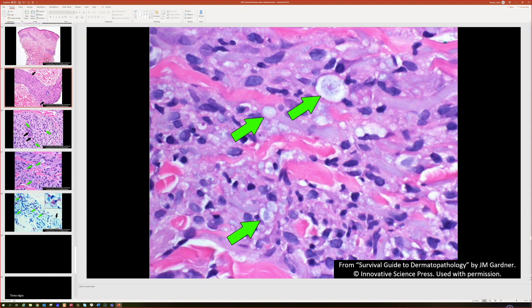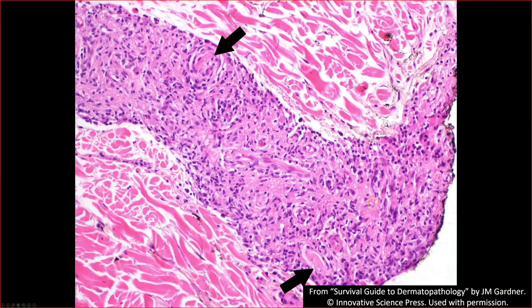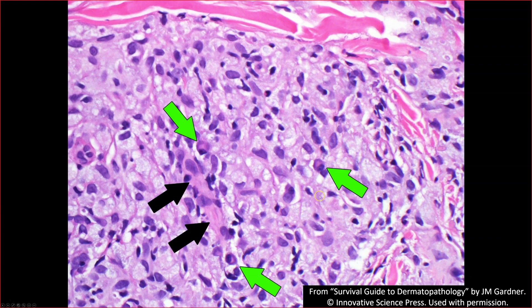Here is leprosy tracking along nerves. And here are plasma cells, which I find to be a really useful clue for leprosy. There's a little tiny nerve in the middle here, and then here are the pale frothy histiocytes.